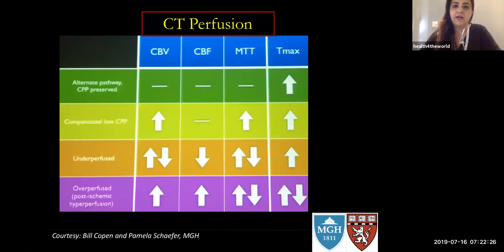And usually when I report my perfusion, I always say there's a defect rather than saying increased or decreased CBV. And if you want to be very accurate, you can say increased or decreased, and you can even use this table and decide which stage the tissue is. It can be useful for neurologists for blood pressure monitoring, if it's underperfused versus overperfused tissue. But again, this can be useful clinically, but also conceptually, it's good to know that there is some variability depending on the stage of tissue.